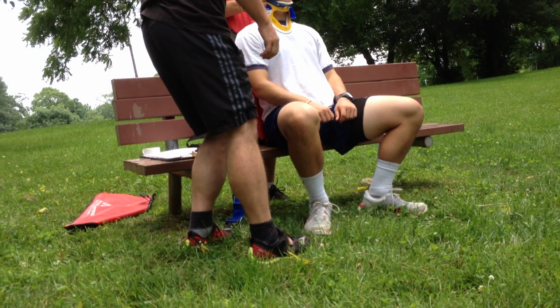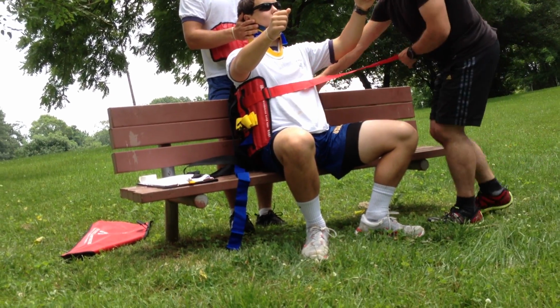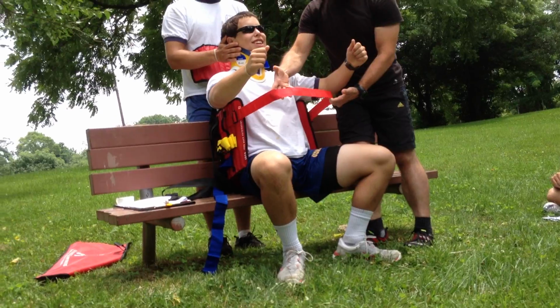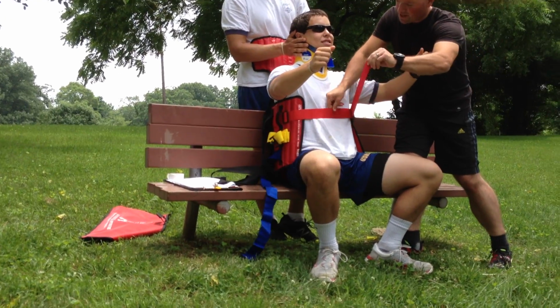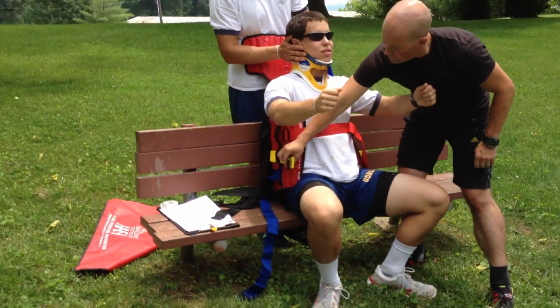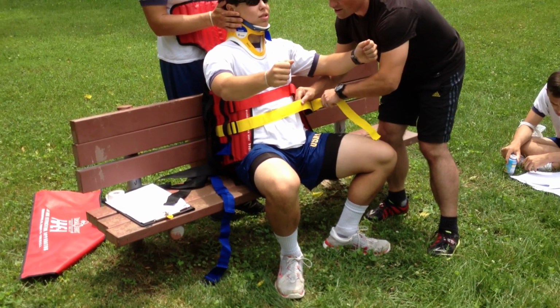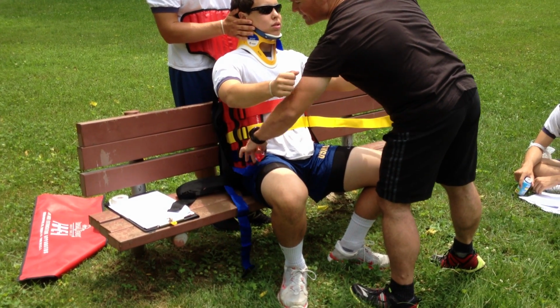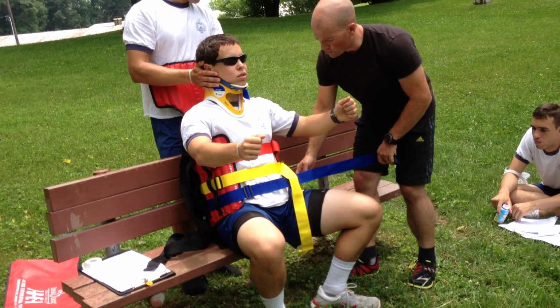So again, grab the steering wheel, sir, but you don't have to lean forward. All right, here comes one buckle. You can see that these are designed for multiple sizes of Americans. In this case, we can get rid of a lot of that slack, but I'm not tightening yet. I'm just positioning at this point. I'm noticing as well that there's some kind of color coding here. On some designs, they're very careful to do like a red, yellow, green type of arrangement.